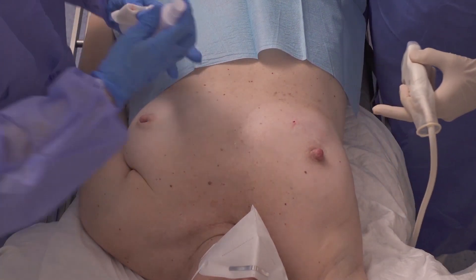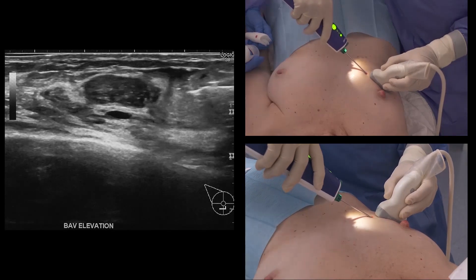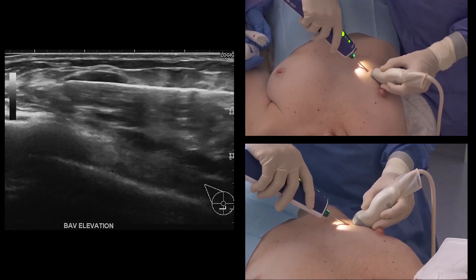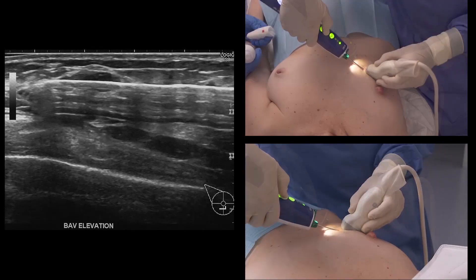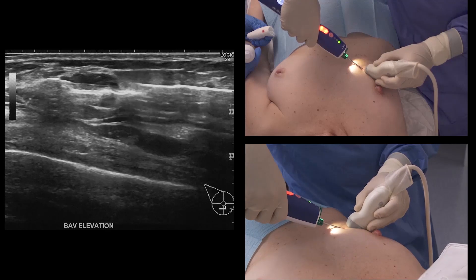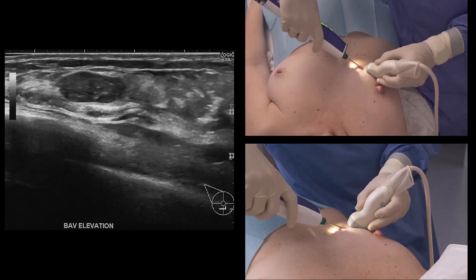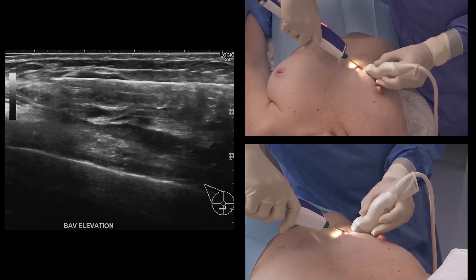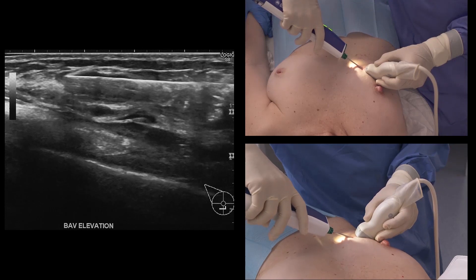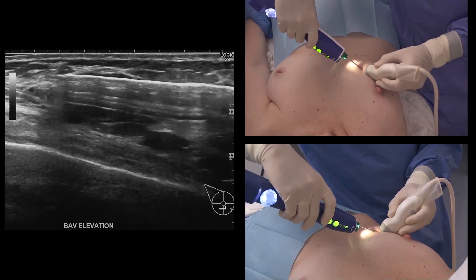Proceed with skin disinfection and needle insertion. Prime pierce is not needed in this case. The needle tip shows beyond the lesion. Press the sampling button to collect each sample after directing the notch towards the desired location.